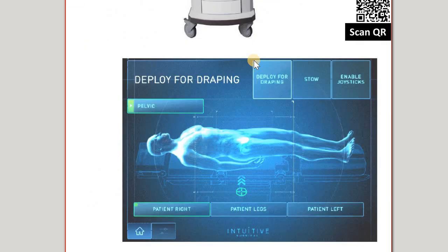Okay. Now before the operation, what happens first is, after the patient is asleep on the table, it makes a 3D scan of the patient, and then they try to figure out the procedure, where the operation will be performed, what will be the steps. So what are the steps for doing the operation? First, the doctor tells the computer the entire structure, that this is what I want to do to the patient, these are the issues. Next, after listening to the doctor, remember, this is an AI enabled system.